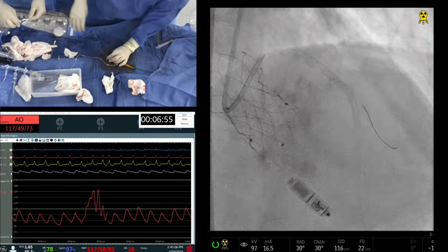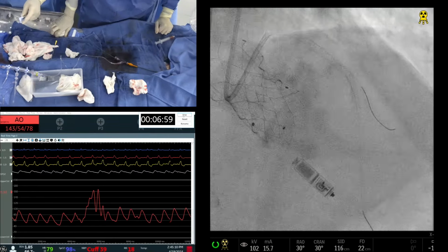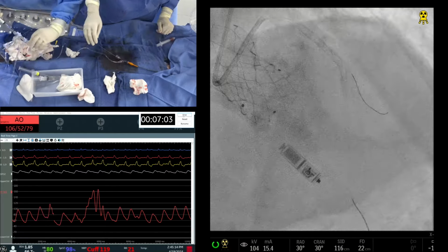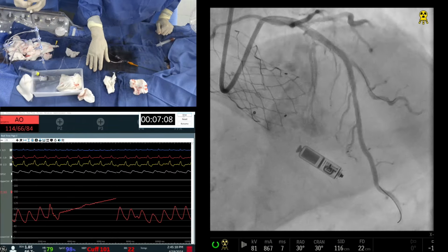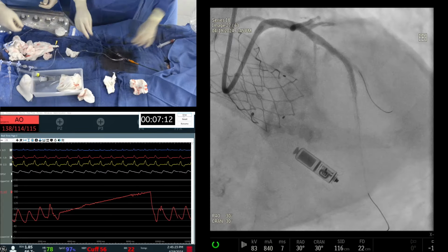Okay. Good. Just dial it. We don't take the picture. Now we take the wire out, right? Before that, let's take a picture to make sure the diag is okay before you take out the wire. Go. Nice. It will always look a little roughed up.